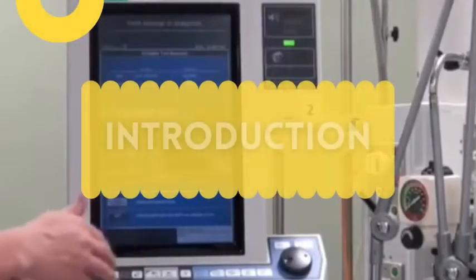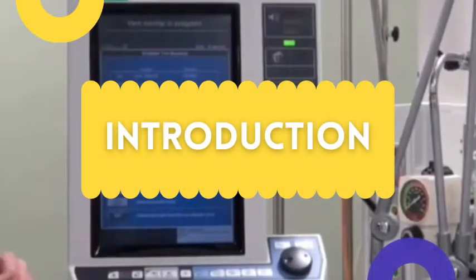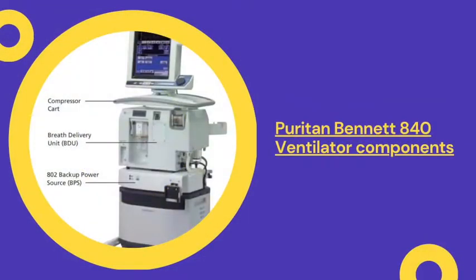Puritan Bennett 840 ventilator system is for acute and subacute care of infant, pediatric, and adult patients. Software options available from Puritan Bennett provide additional ventilation functions. Puritan Bennett 840 ventilator components: user interface, compressor cart, breath delivery unit, backup power source.